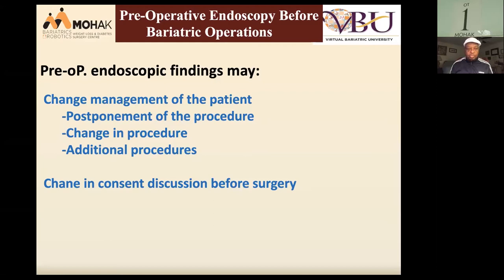So why is pre-op endoscopy important? It can change the management of the patient. You can change some medical treatment before the procedure, and it does sometimes necessitate postponement of the procedure. It can change the procedure, and at times it might allow us to do additional procedures. Like sometimes in patients who have a large hiatal hernia and we are going to do a gastric bypass, we repair the hiatal hernia and then do the gastric bypass. And sometimes there's a change in the consent discussion before the surgery.